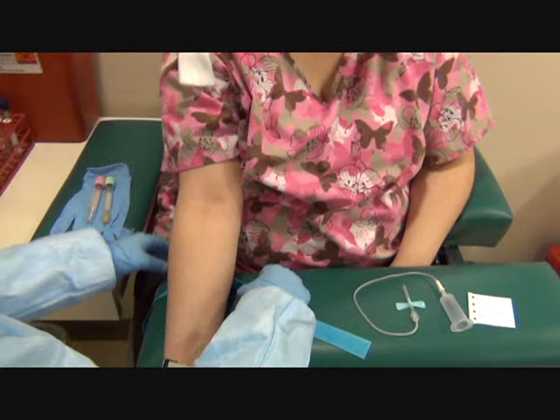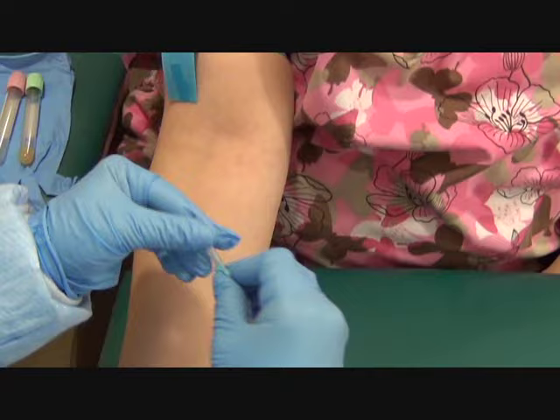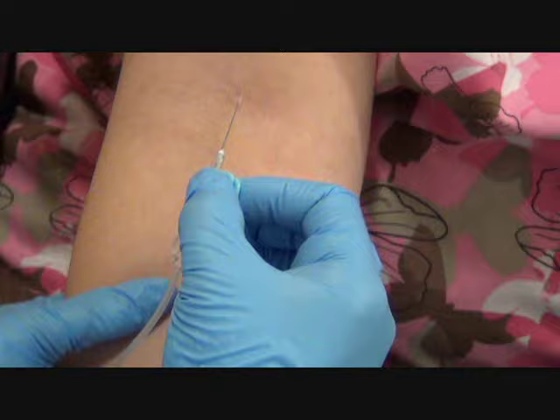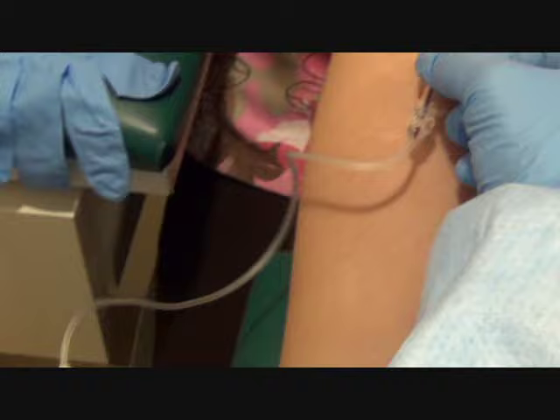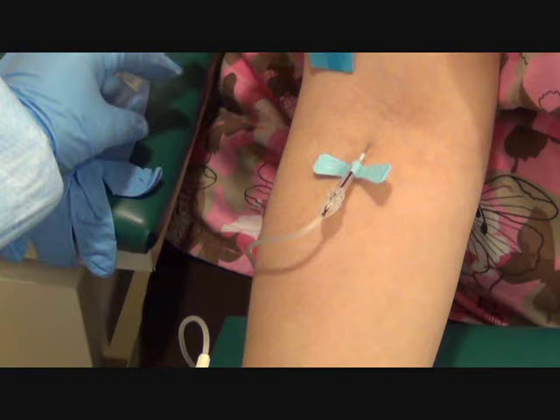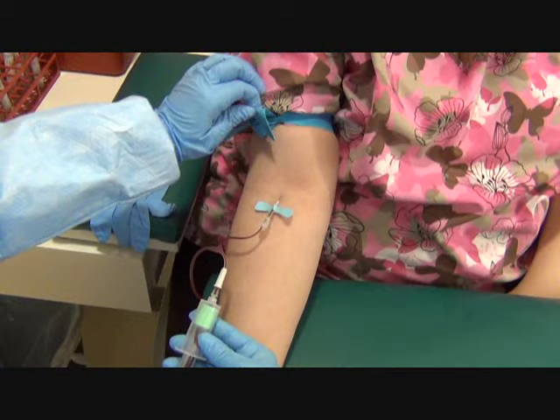Does it feel dry? Yes. Tie the tourniquet four inches above the site again. Make a fist, put your arm straight. I want to make sure I hold the wings, anchor the skin, thread the needle in. I got a flash of blood. Before I let go of the wings, I want to grab my hub — let it go. Make sure I get a good flow before I pop off the tourniquet. I'm getting a flow. I want to make sure it fills from the bottom up so I don't have any reflux. I just pop the tourniquet.